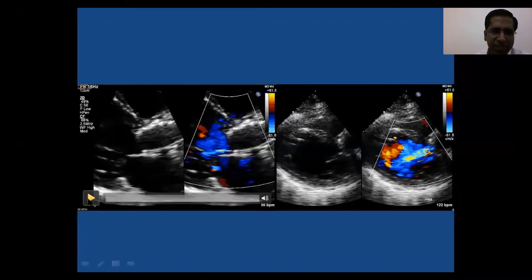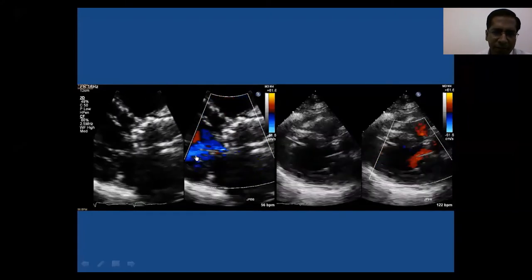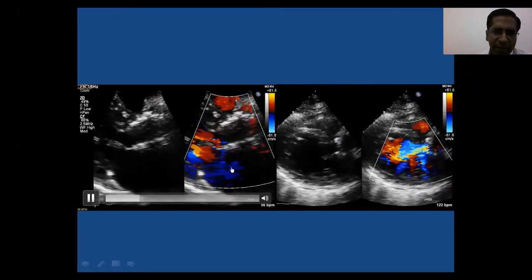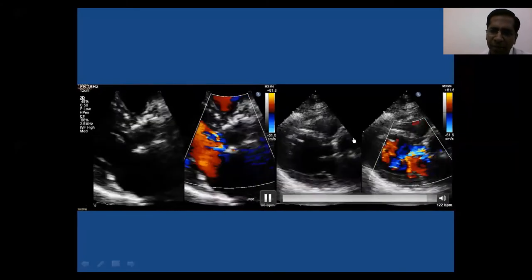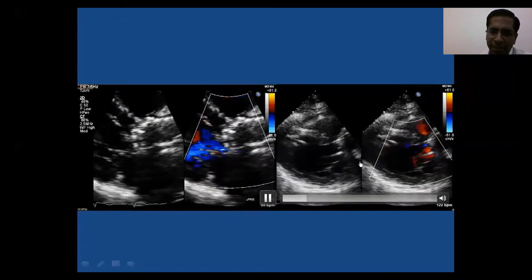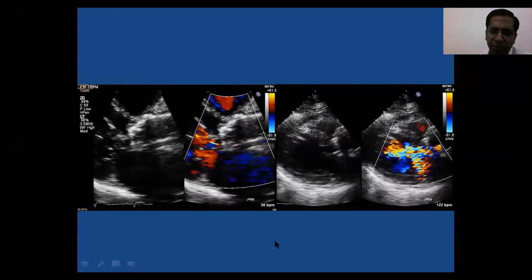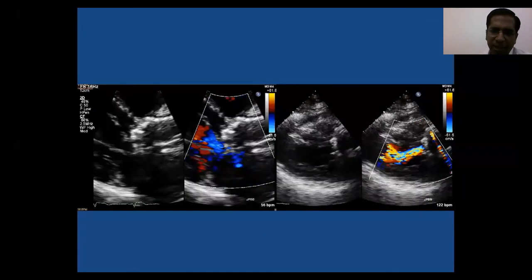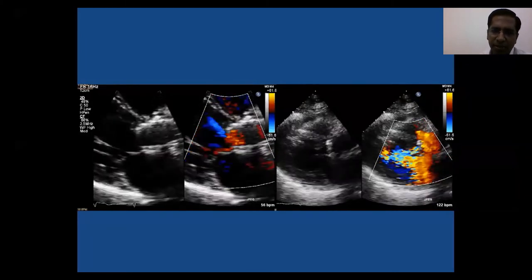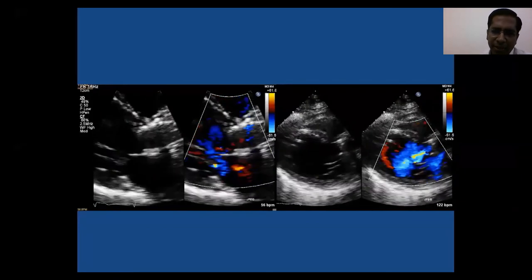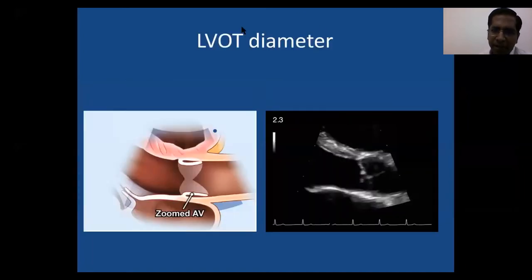Next, look at the color flow pattern. A TAVI valve may show a mild paravalvular leak, while a metallic valve may show intra-prosthetic leak. The distinction matters because implications and causes differ. Also assess the antegrade flow — is it very turbulent or more laminar? These details come from applying color Doppler.